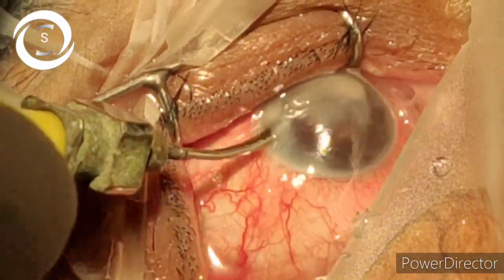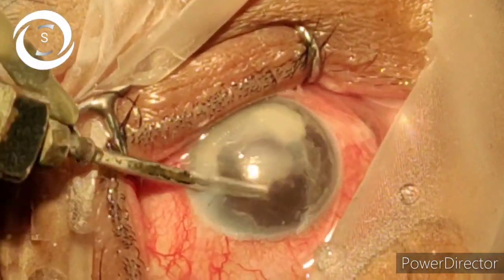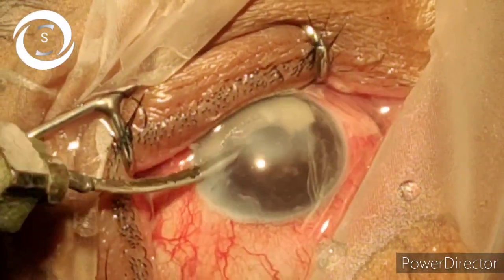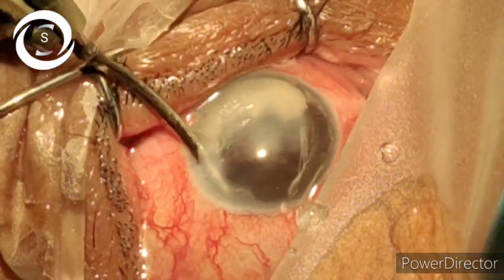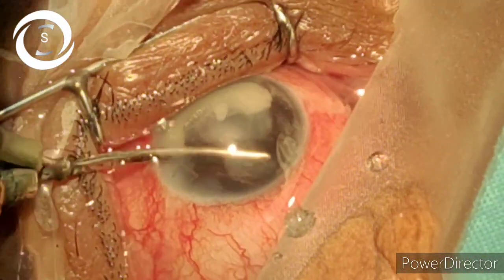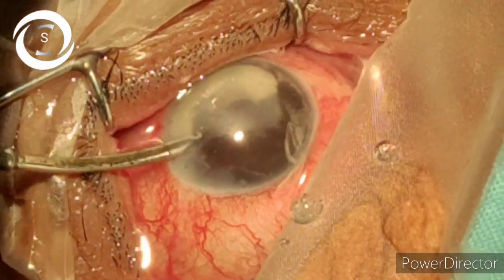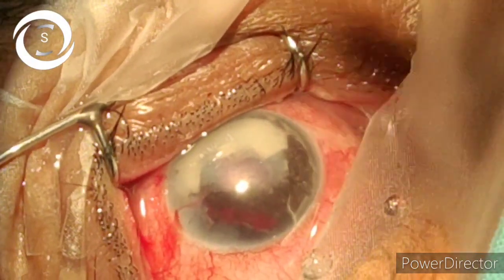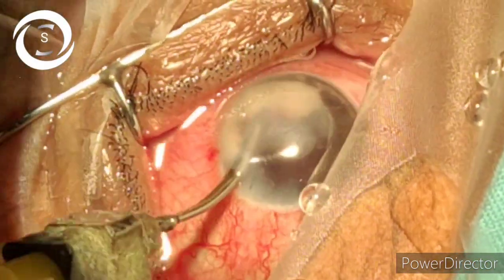With the help of an irrigation-aspiration cannula, I am slowly and gradually removing the exudate inside the anterior chamber. You can see the shining cornea above the exudates. You can see I have cleared almost half of the anterior chamber. The exudate had made anterior synechiae, and the iris was also very friable and bleeding, but I carried on the anterior chamber wash.